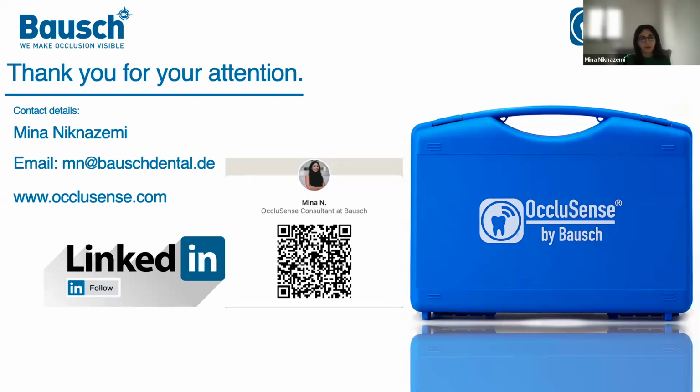So the color transfer, once the color transfer is done, I understand there probably wouldn't be enough color to be transferred the next time. Am I correct, or how is it possible? For example, when you use an articulating paper, once you have the patient biting on the teeth, the color transfer happens, and then if you try to use the same paper again, because typically we end up putting it in the same place, there wouldn't be any color to be further transferred. So how does that happen in OccluSense sensors?